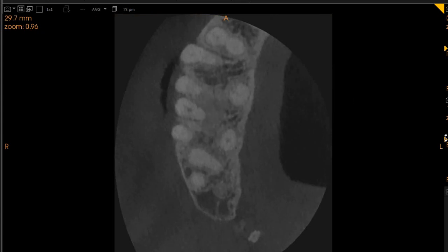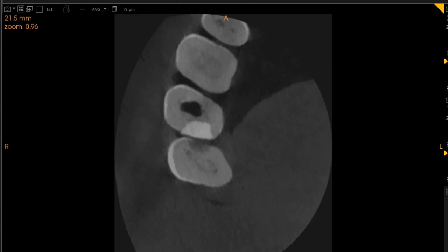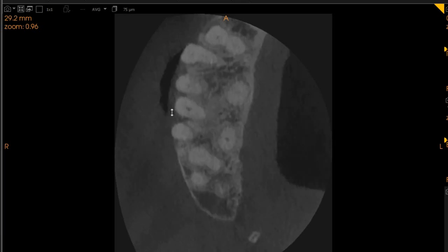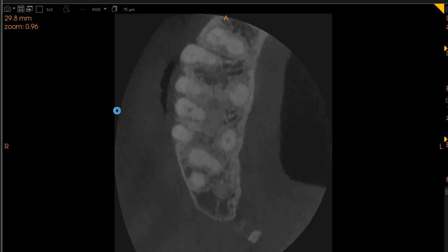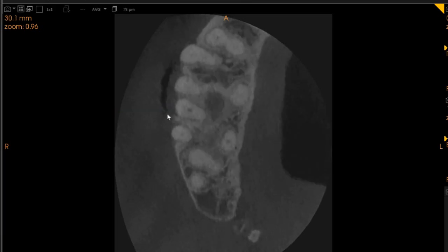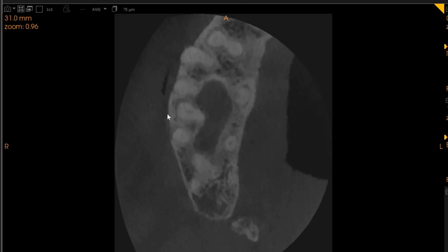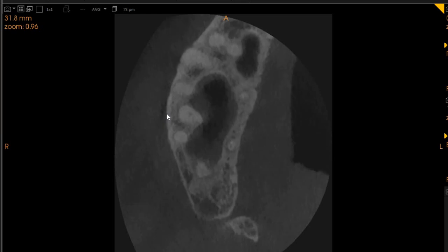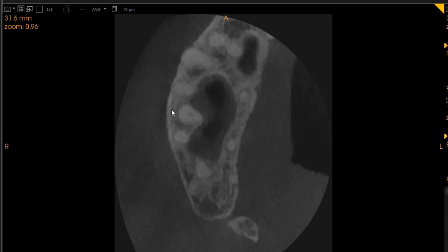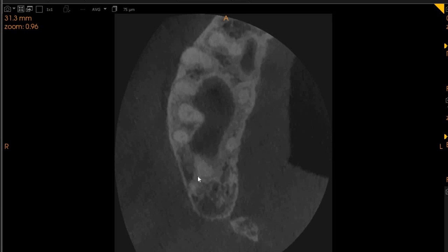This is the axial view. So, the three canals, significant bone loss here. And as we move down towards the apex, you actually notice the crack in the meso-buccal root here as well.